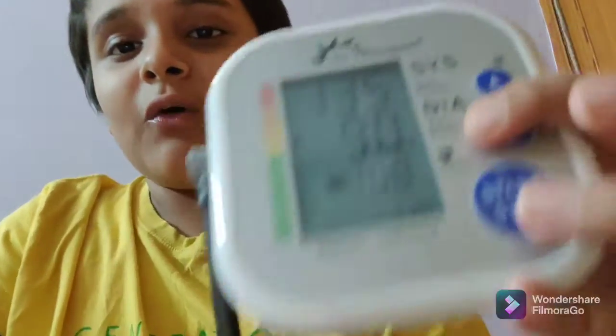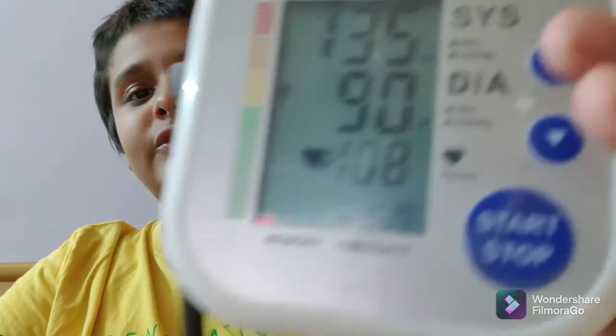Now I'll show you how to measure BP from this machine. Taking God's name and switching it on — note that when you switch it on, the wrap will start pressing your hand quite firmly. After the measurement is done, my BP reading is 135 over 90 and the pulse rate is 108. That's how you measure BP using this machine. One more tip: the wrap should be placed at the correct position on your arm as shown in the manual — at that specific part of your hand — for the machine to track your BP most accurately.